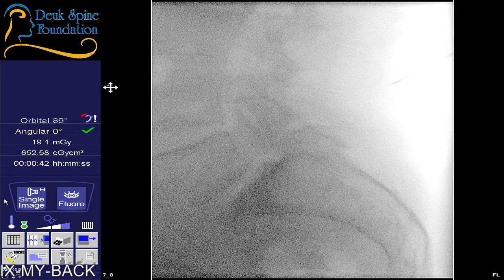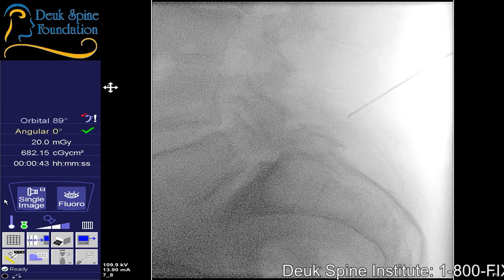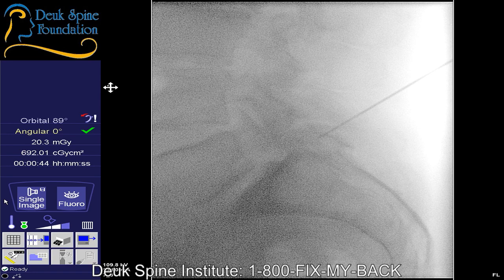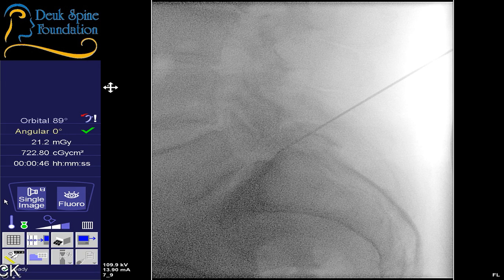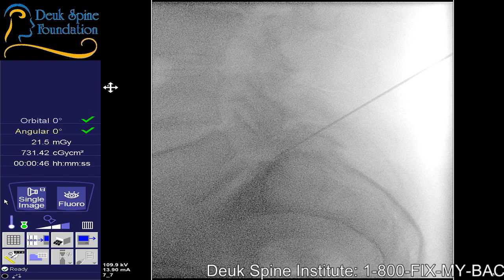Shot. It's too high. Shot. I'm trying to come in as low as I can. Shot. AP. So we're starting with the hardest level. I don't expect much difficulty with the others, but I'm still working on L5-S1.